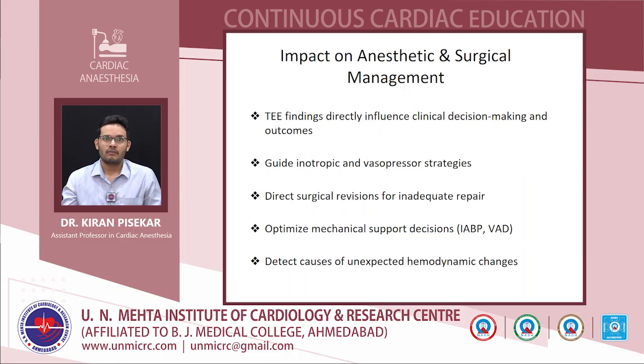Also I want to highlight here, by using TEE for goal directed fluid therapy, we can measure the aortic VTI or LVOT VTI. If there is a variation of more than 20%, then the patient will be volume responsive, and we can give volume to that patient.